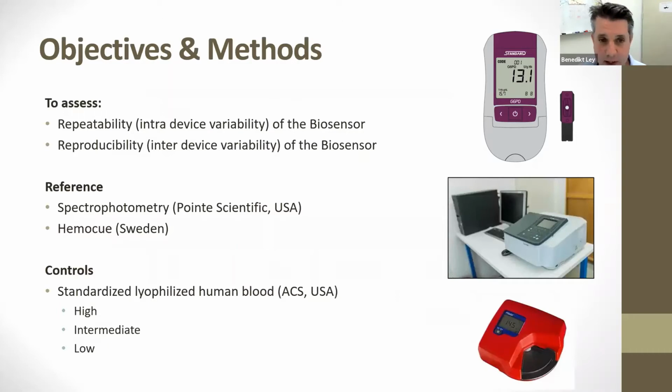Following Daniel Pfeffer's paper, we were interested to see how much the results from the biosensor would differ when performed repeatedly, which seemed essential to us given the very good performance that we had seen in the field in Bangladesh, for example.